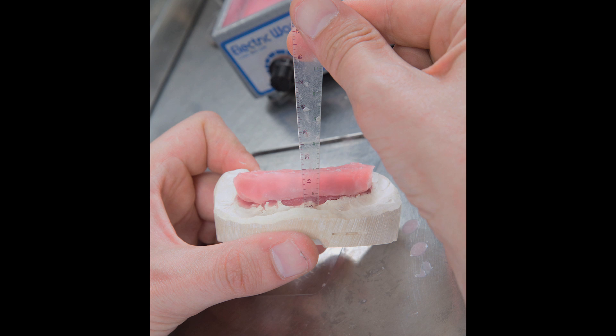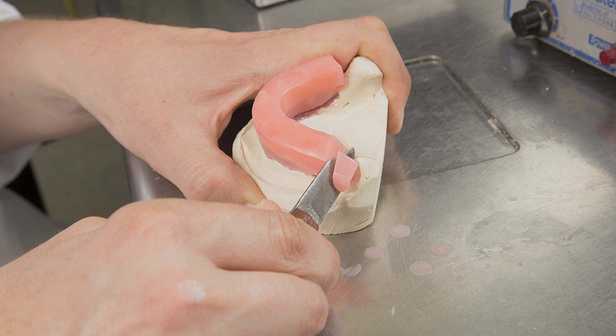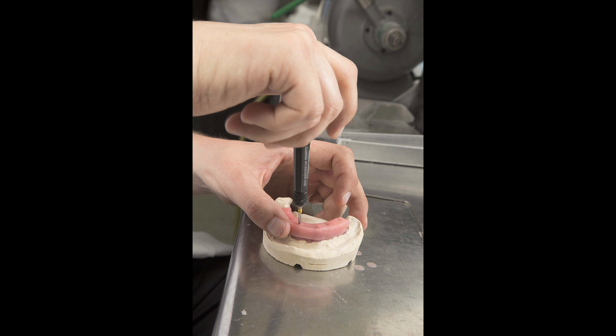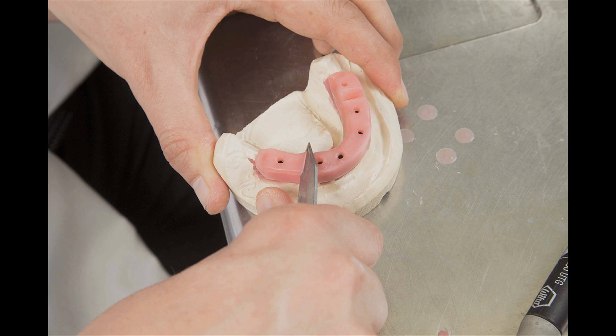The occlusal height of the bite block from the base of the vestibule should measure approximately 18 millimeters and is trimmed accordingly. To facilitate jaw function, the bilateral posterior ends of the bite block are cut at 45 degree angles in an anterior-posterior direction. Access holes are created where the pins served as guides through the wax to the underlying screws. After unscrewing it from the model, the bite block is trimmed and shaped as needed to form a smooth surface. It is then reseated on the model, and bilateral V notches, or retention grooves, are carved into the posterior occlusal surfaces. These notches are added for the purpose of retaining impression material from the opposing arch in order to provide accuracy in recording the patient's bite.